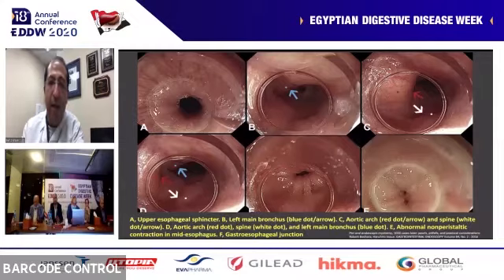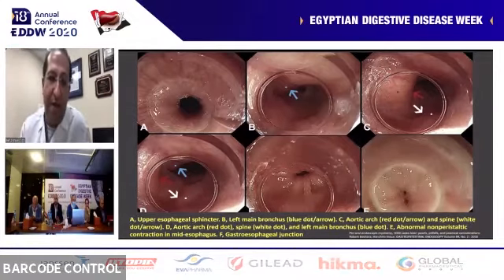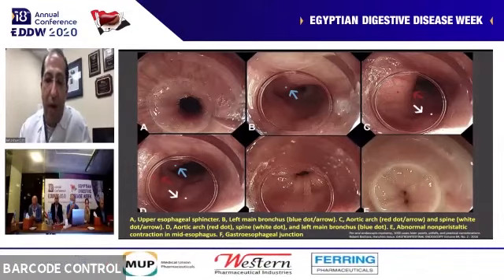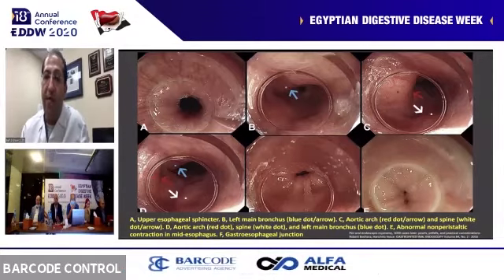It's very important as an endoscopist, if you decide to do this, to understand landmarks in the esophagus. They say that the blue arrow shows you the left main bronchus. So this is a plane, in picture B, that we don't come close to. We always work toward either 1 to 2 o'clock or 5 to 6 o'clock. So we're away from that left main bronchus that's around 11 o'clock.